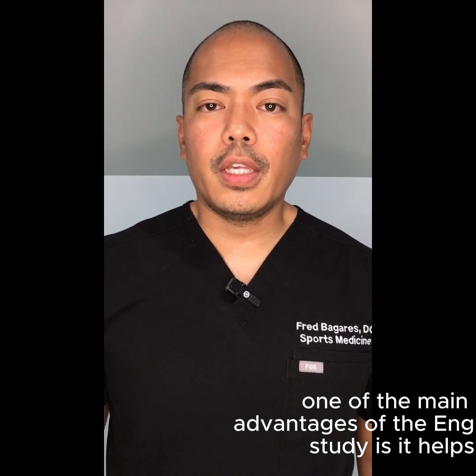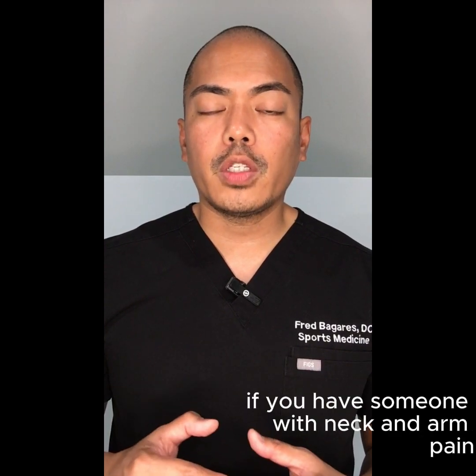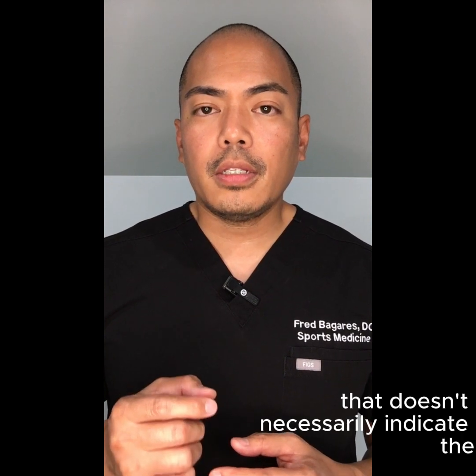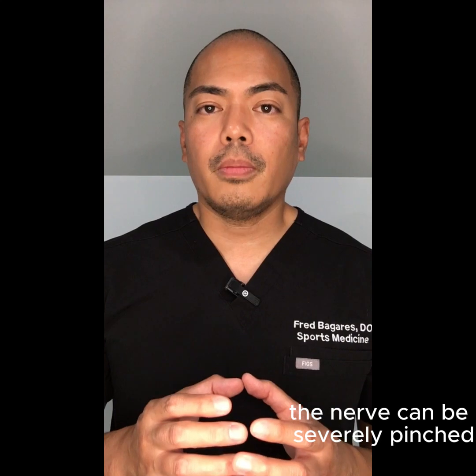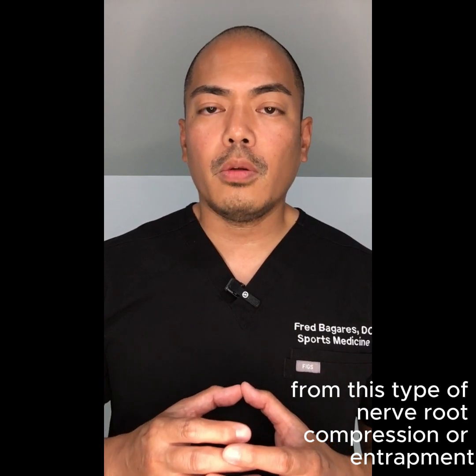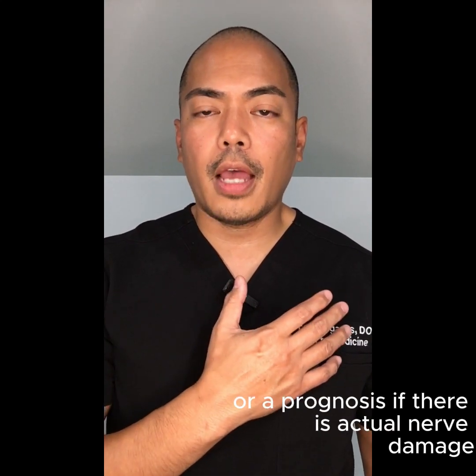One of the main advantages of the EMG study is it helps add to the overall diagnostic picture. So as an example, if you have someone with neck and arm pain and an MRI demonstrates a nerve root getting impinged, such as the C6 or the C7 nerve root, that doesn't necessarily indicate how the nerve is functioning. So even though on MRI, the nerve can be severely pinched by a disc herniation or overall stenosis, it doesn't actually give any value in terms of the severity. Someone can have extremely severe pain from this type of nerve root compression or entrapment, but it doesn't necessarily give us value or a prognosis if there is actual nerve damage.